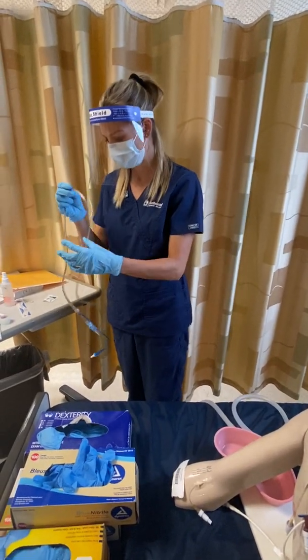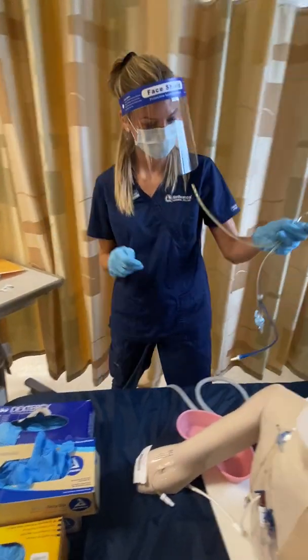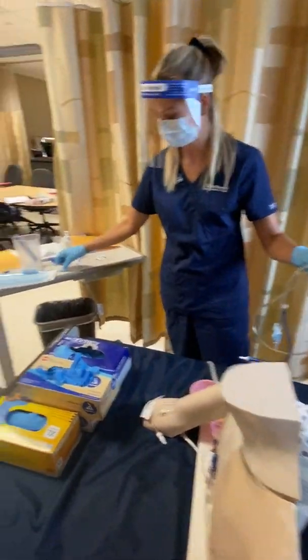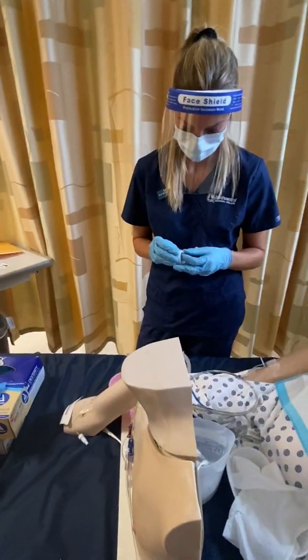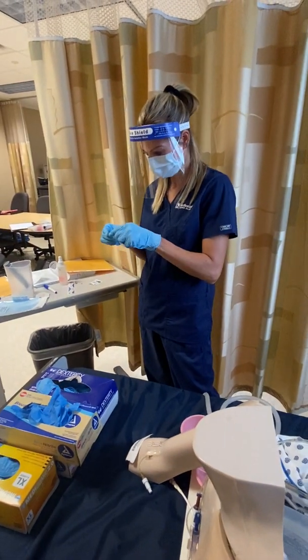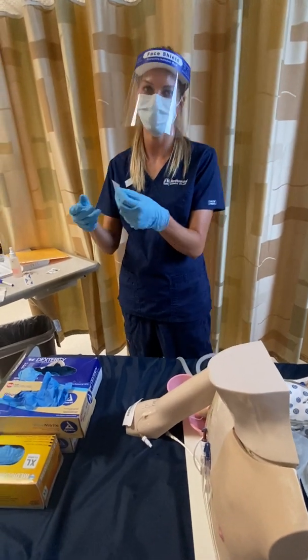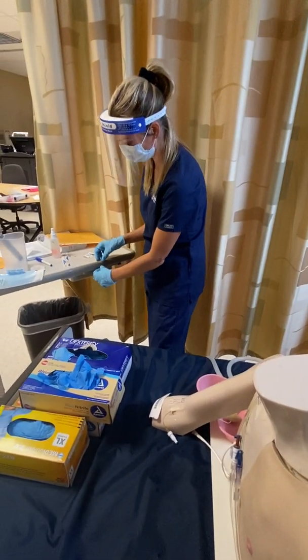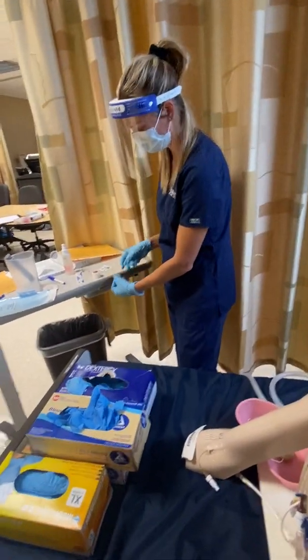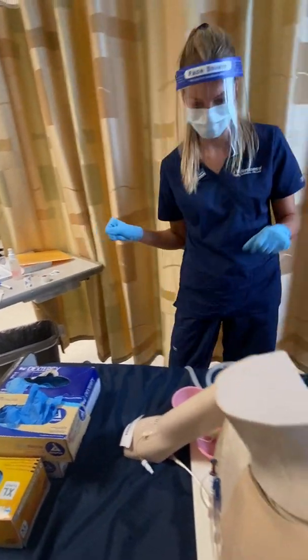Okay, all right, so now that I have that marked up, I've already got my gloves on, and I could get a piece of tape ready for her to put on her nose when done. And I know at Aspirus they have special tape that you can use on a patient's nose, a gentle tape for an NG tube, but otherwise you can just use a piece of grip tape. All prepped up. Okay, all right.